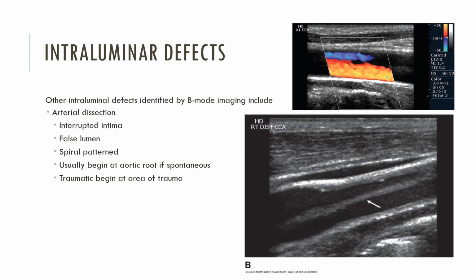So when you have a dissection, your tunica intima is separated from your tunica media. And over time, it's going to start pumping blood into what we call the false lumen, because it has nowhere to go. Eventually, we hope that that intima will reattach or stay attached to our tunica media. So in this case, you see the true lumen is here. That's the original vessel. However, the false lumen, we're pumping blood into this basically pouch with no end, and we call that the false lumen.